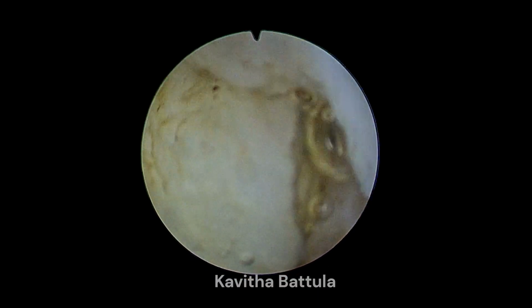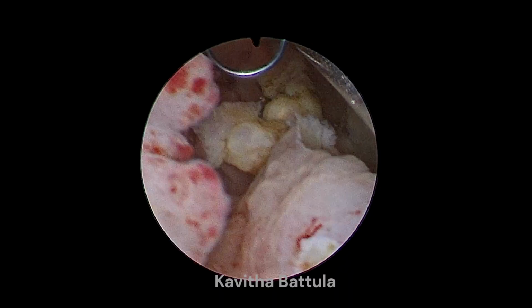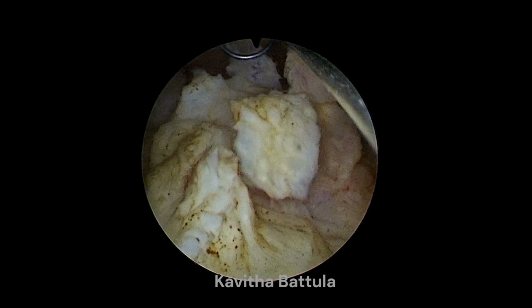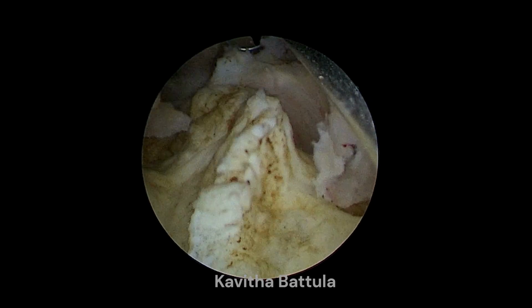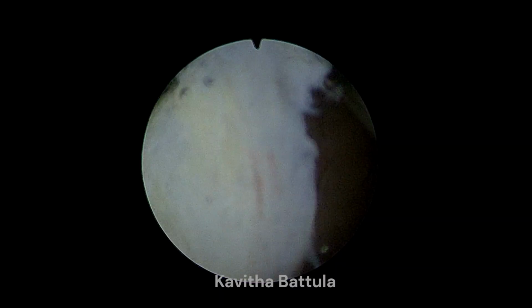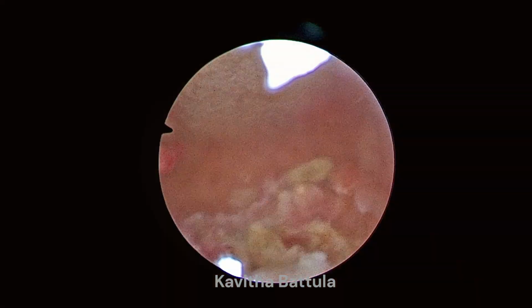We now see the fibroids being resected. Initially, the posterior wall fibroid, later, the anterior wall type 0 fibroid. The equipment we have used is a mini hysteroscope or mini resectoscope. It's a bipolar resectoscope of 18.5 French diameter. The distension media used is saline.